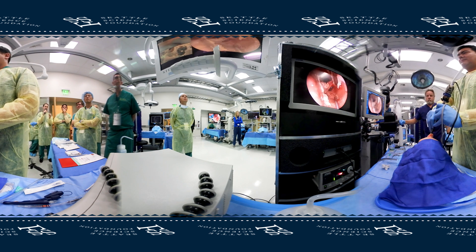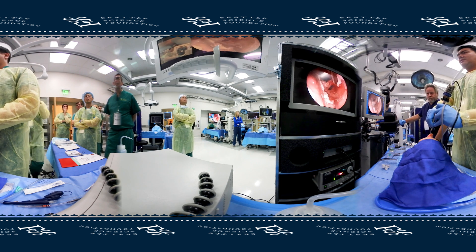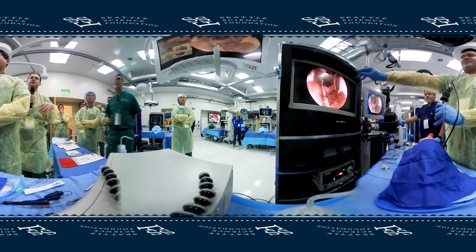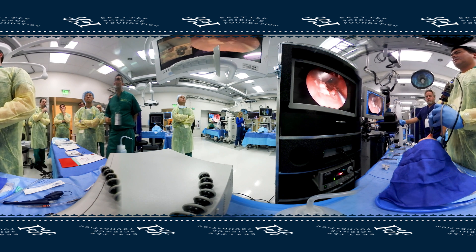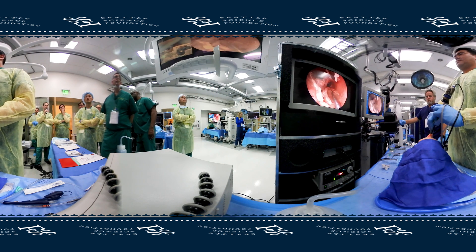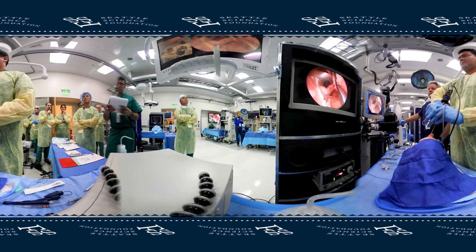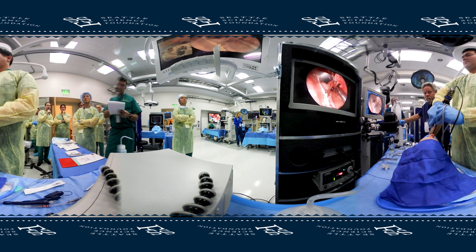Usually you take that flap and keep it attached along the floor. If you keep it attached along the floor and make your incisions up to that maxillary os, that's another option. You can use the maxillary sinus mucosa for the flap or you can just use the nasal floor mucosa. For the flap incision, I use either needlepoint cautery or just a bent protected bovie tip — it's nice because then you get hemostasis at the same time.